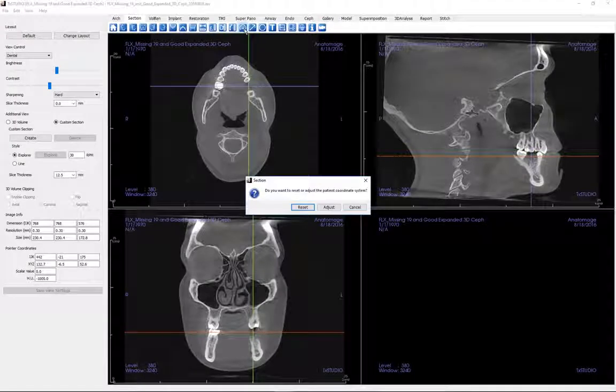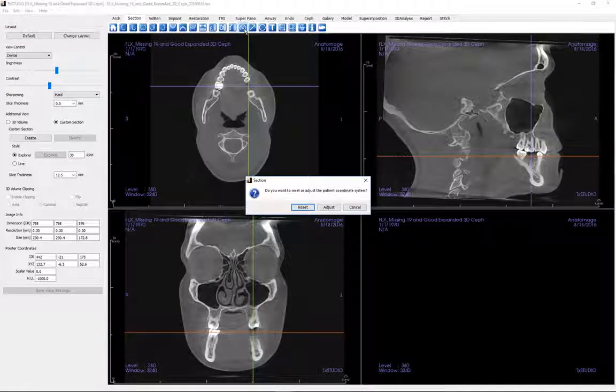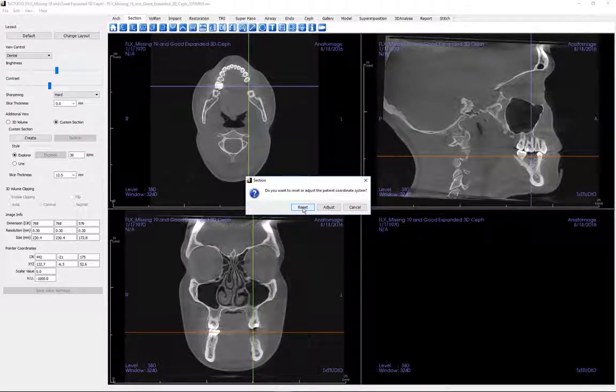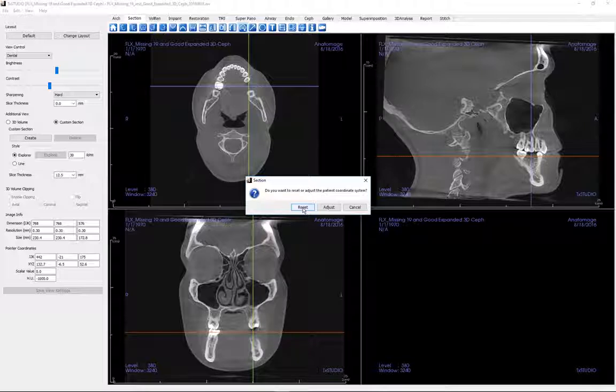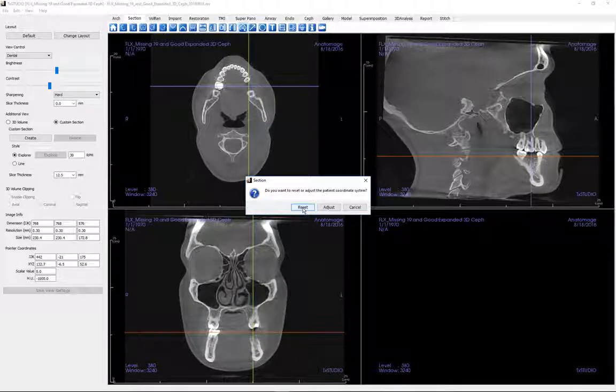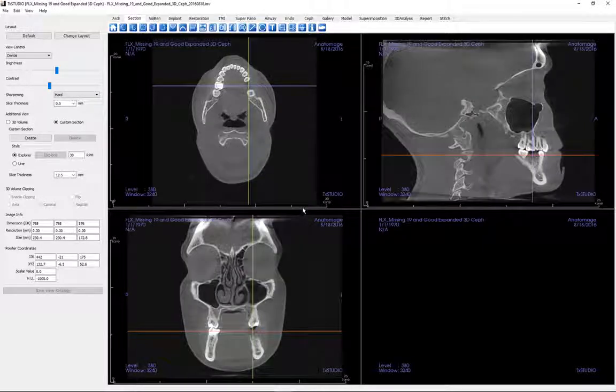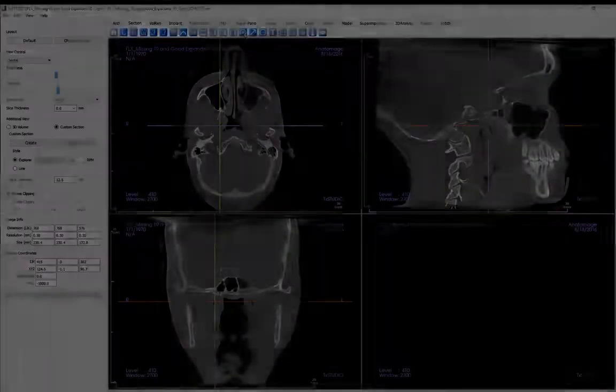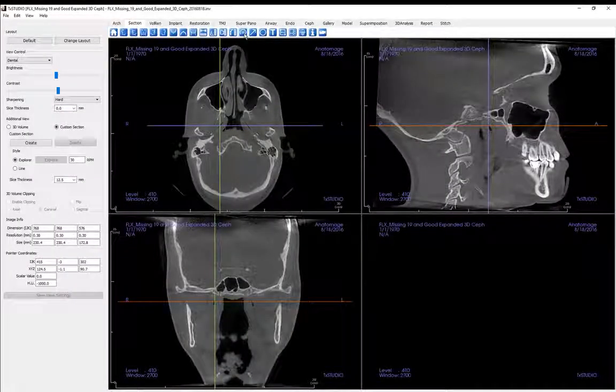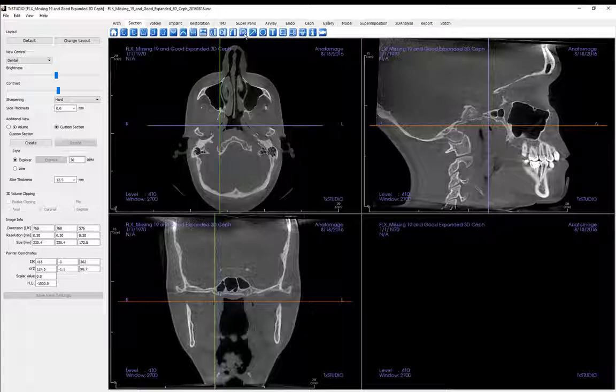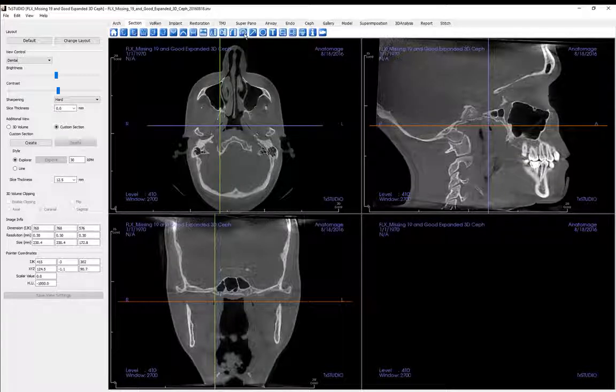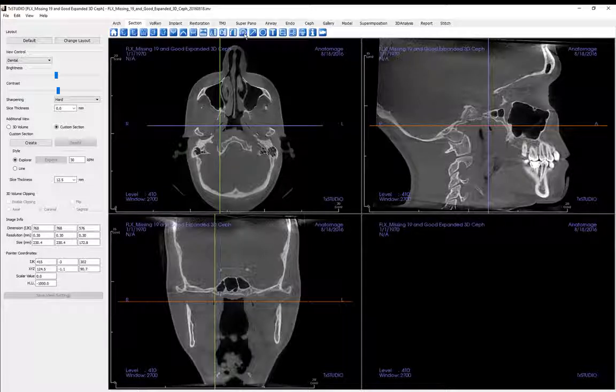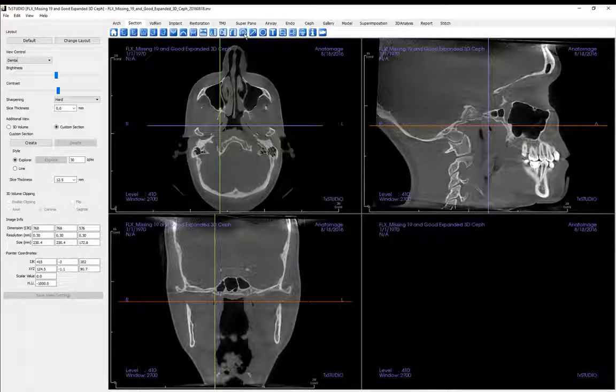No changes will be made to the original DICOM scan data. If you click the icon again, you can adjust the volume's orientation or reset it to the original positioning. Measurement errors in cross-sectional slices can occur without proper patient positioning. This can be especially problematic when determining the length of an implant that would border the sinus cavity or the inferior alveolar nerve.